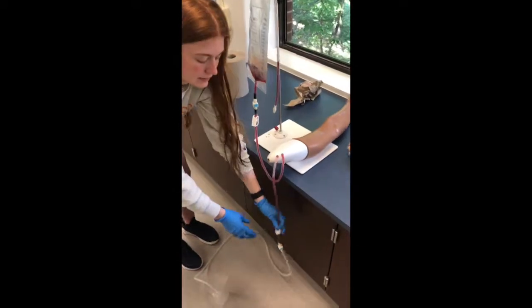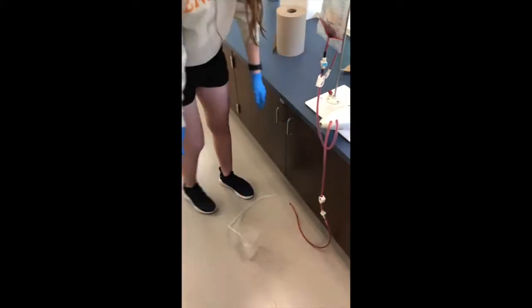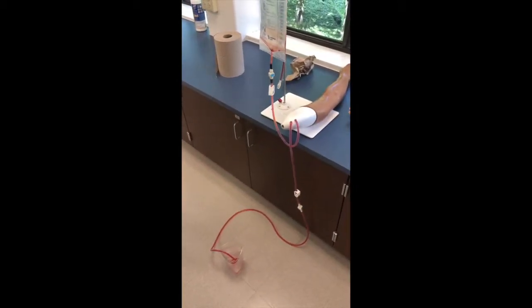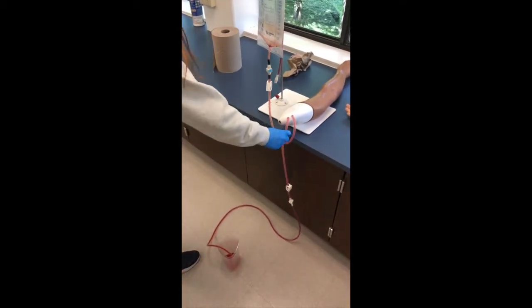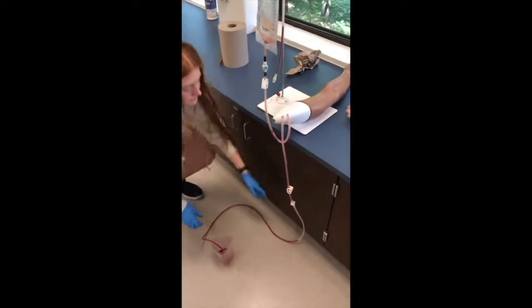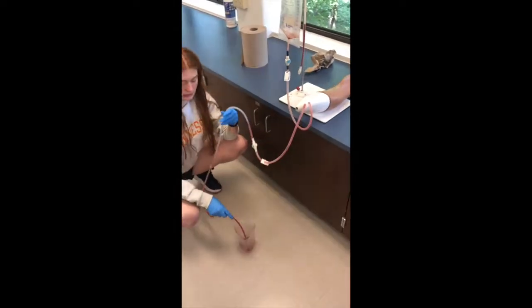Once you have that connected, release both clamps and you should see the blood start flowing just like it is right here. It shouldn't take too long — just a couple of seconds. Sometimes if it gets stuck, just pick up the tube and let it drip out slowly.